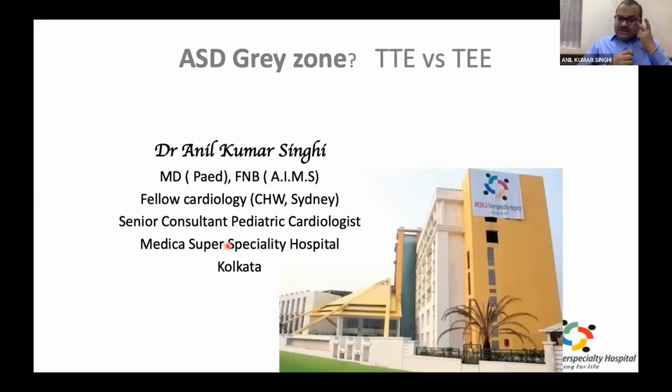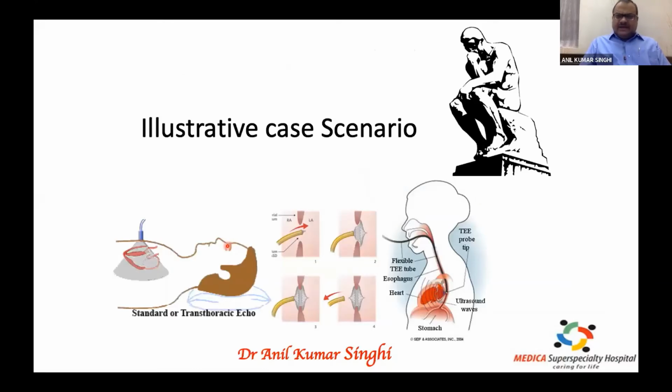Role of imaging in ASD, how it alters the decision making and outcome. So some illustrative case scenarios I will be discussing with a special reference to transthoracic and transesophageal echocardiogram.